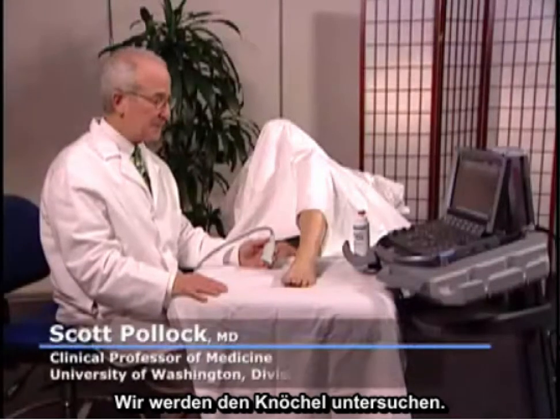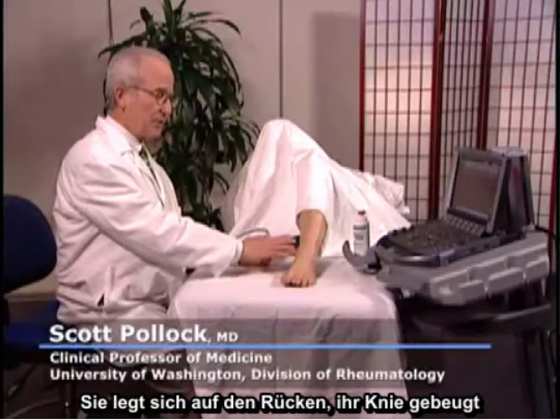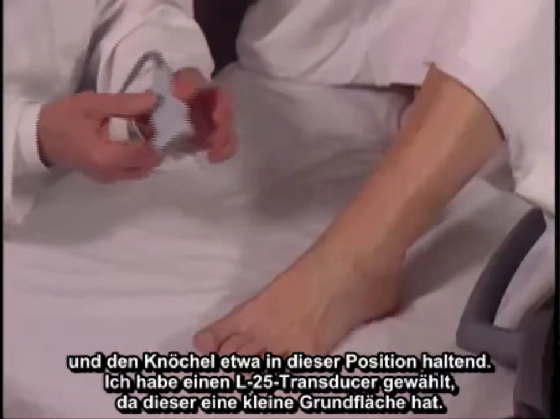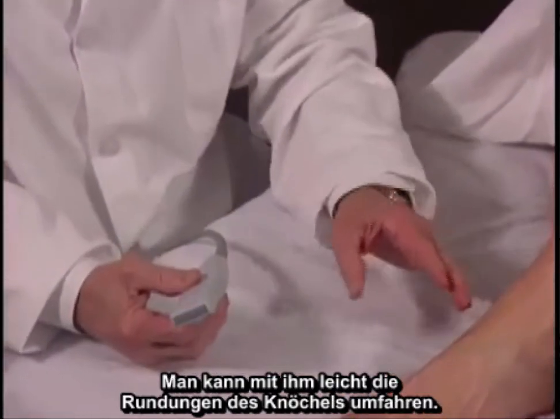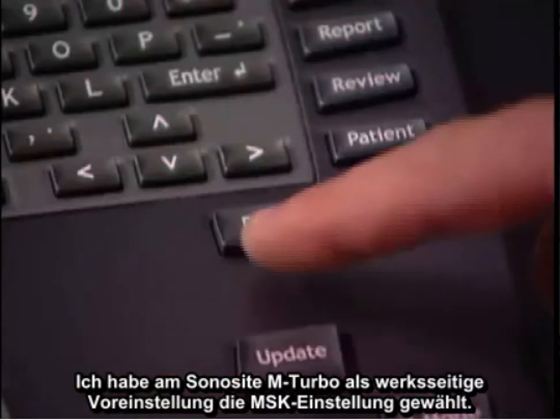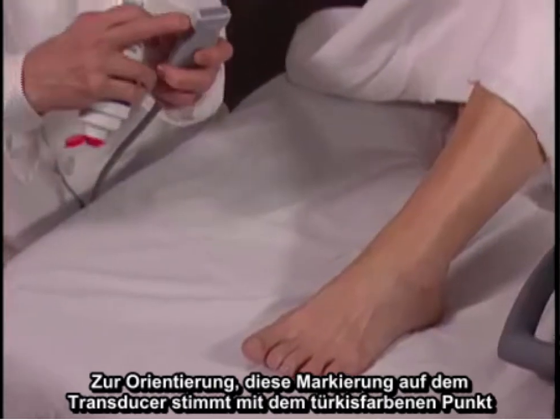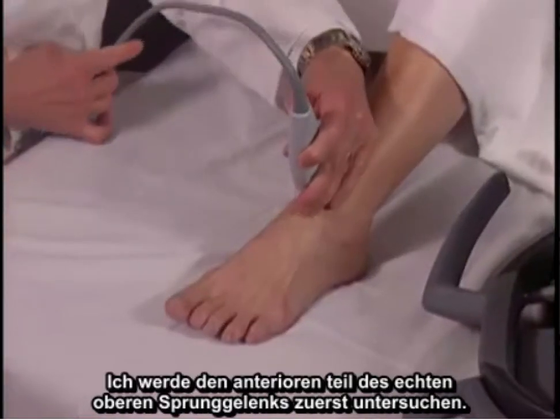We're going to examine the ankle with the patient lying on her back, knee flexed. I've selected an L25 transducer because it has a small footprint and is easy to get around the curves in the ankle. On the Sonosite M turbo, I've set the factory preset for MSK. For orientation, the mark on the transducer corresponds to the turquoise dot on the upper left portion of the screen.